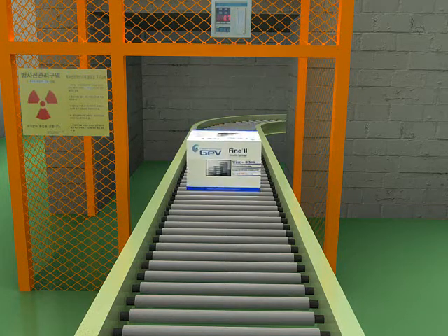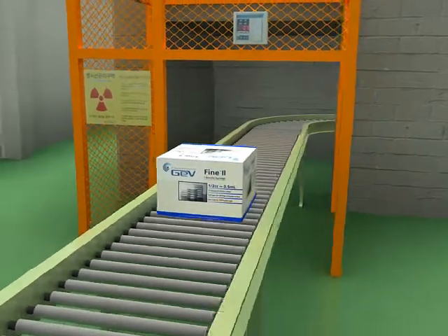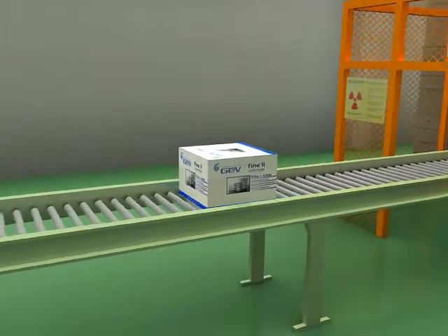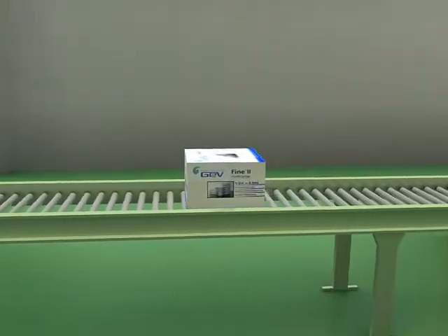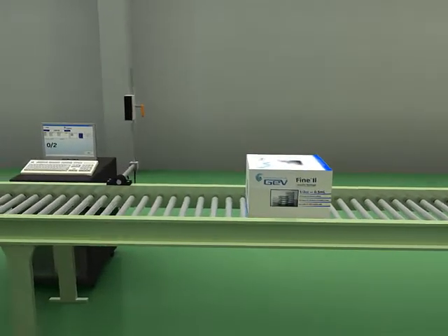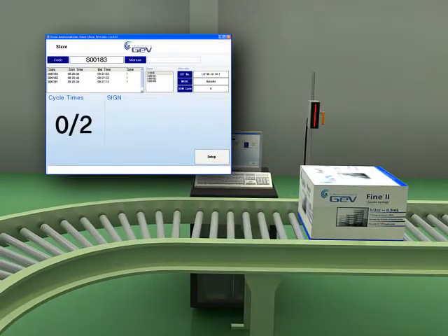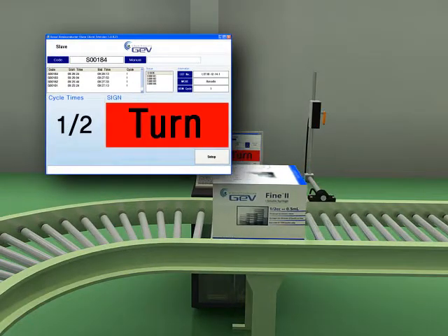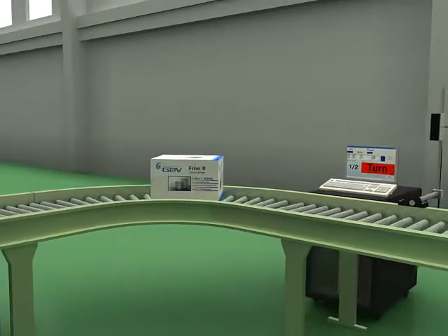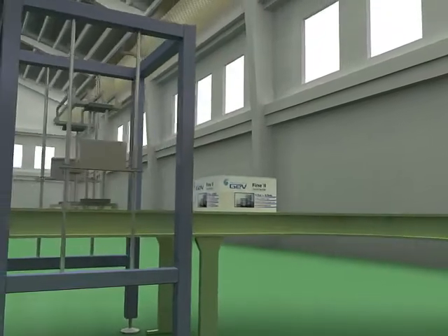Products that have completed one round of irradiation are coming out to the outfeed zone. The barcodes of the products that have just come out are read, and their processing histories are recorded. These are then compared with the product specifications in the database, after which the next process signal is sent to the automatic system.